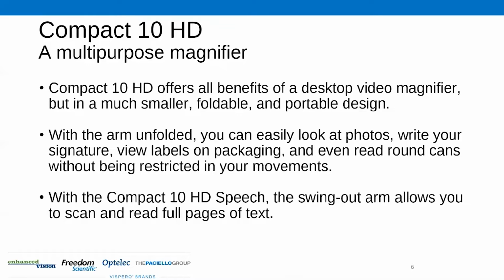Or what if you're at the library and you're doing research on a topic, you can snap some images at the library, store it on this device, and then you can go back to your dorm room and review the information that you have on the unit while you're writing your paper. So it's really a powerful tool.